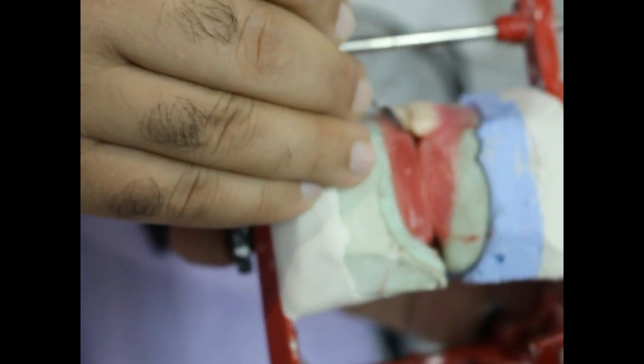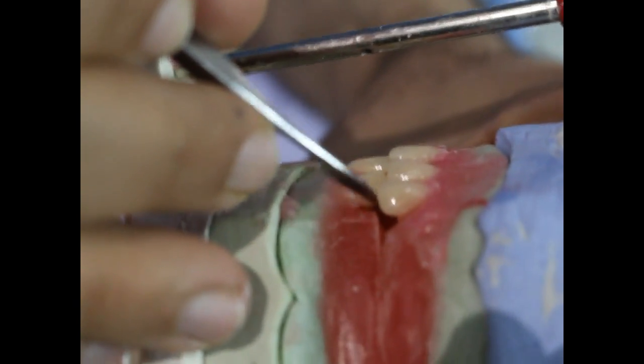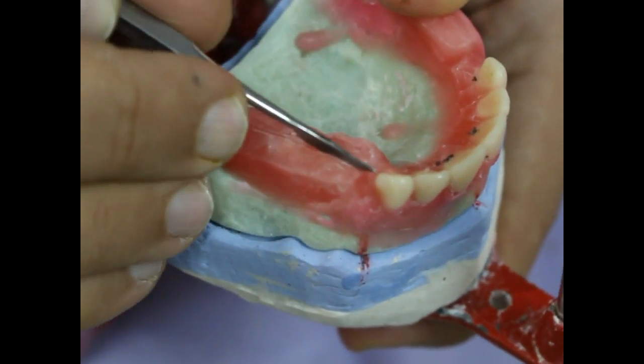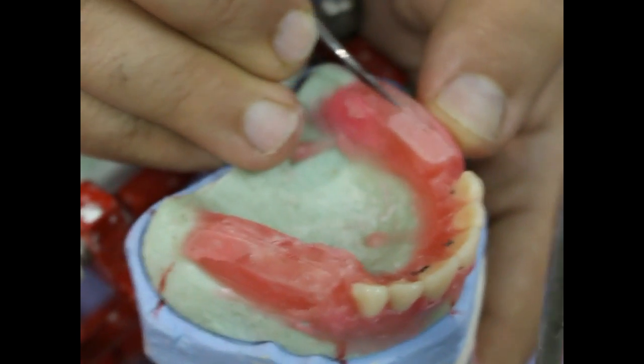The cusp tip of the canine is in line with the distal end of the lower canine, both on right and left sides. We can see that the distal slope of the maxillary canine is pointing towards the centre of the crest of the ridge, both on left and right sides. This is necessary to create what we call lateral balance.